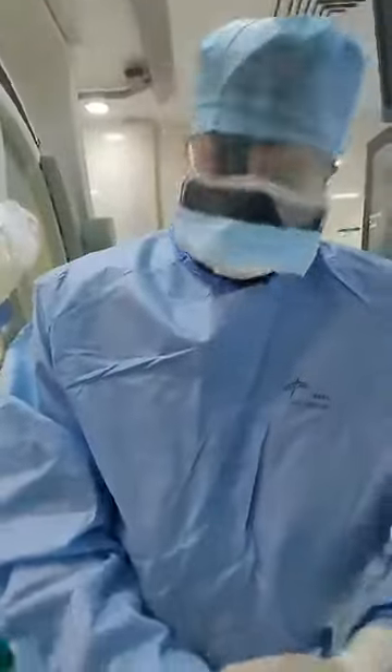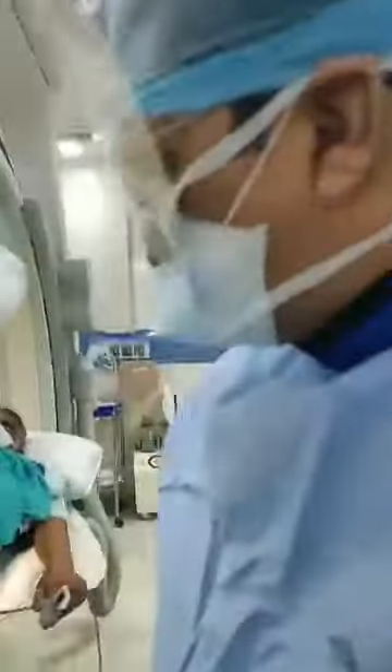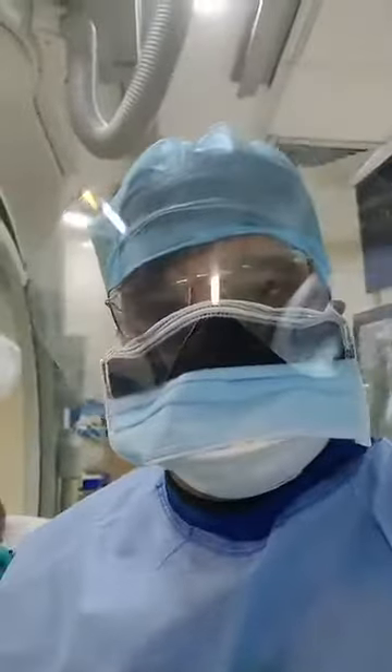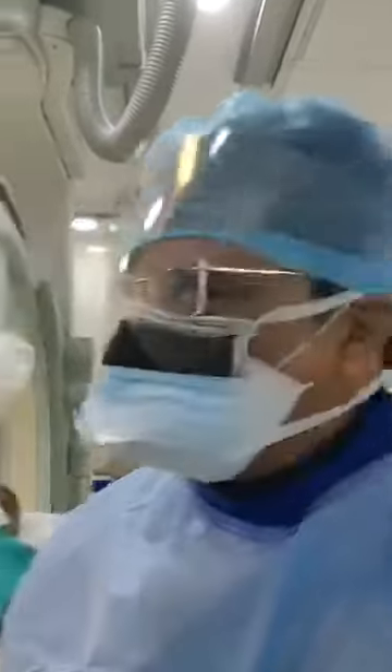Now we are finishing the angiography and we will plan an angioplasty procedure. I hope you are able to understand this procedure. With the help of our nurses and technicians, and myself Dr. Vivek Gupta at Apollo Hospital, New Delhi — if we plan an angioplasty I will show you that on Facebook live also. Thank you very much.